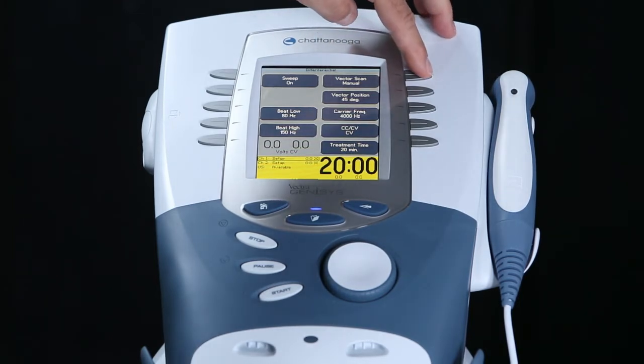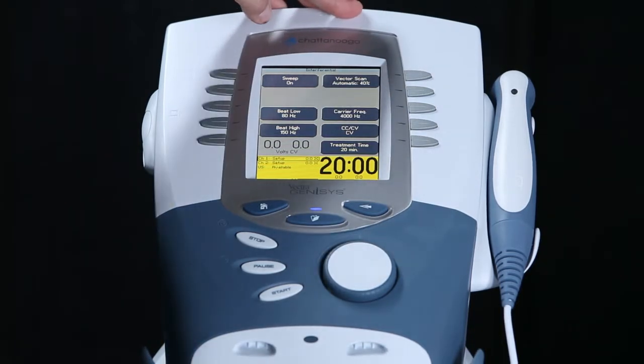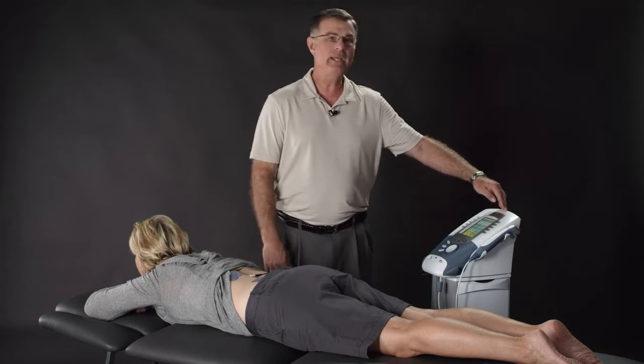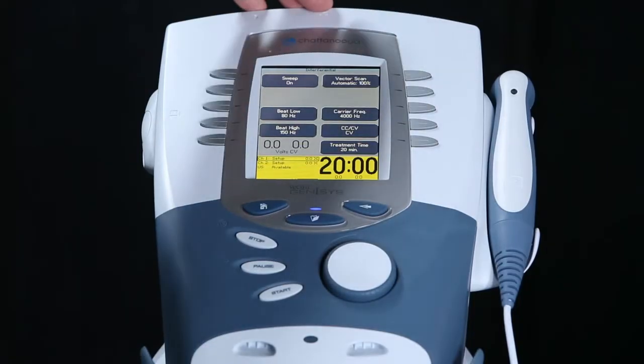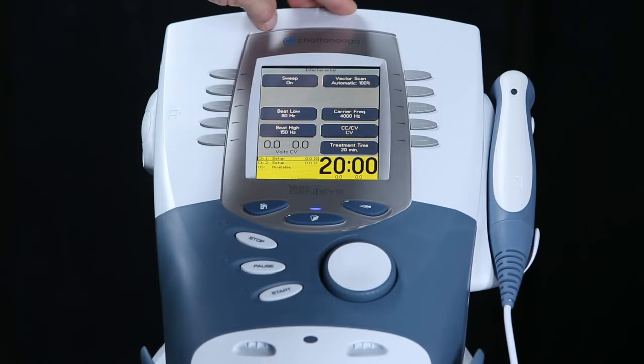The next thing we can do with vector scan is that we can make it an automatic modulation. Again, modulation is important to prevent that patient accommodation, so we can now automatically modulate the amplitude by 40% of the total, or we can modulate it to 100% of the total. For our patient comfort and safety today, we're going to modulate at 100%.